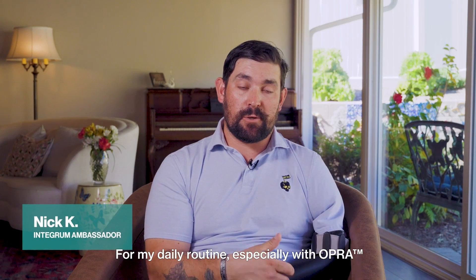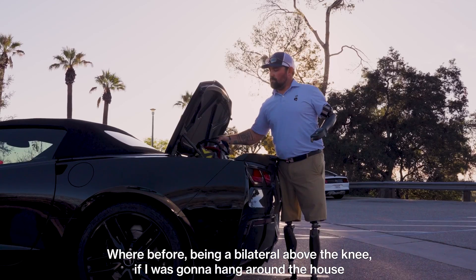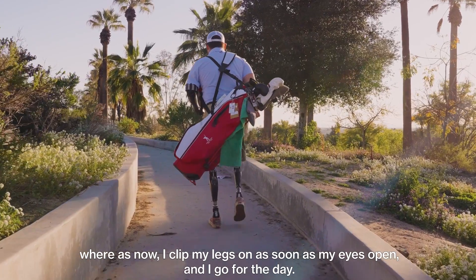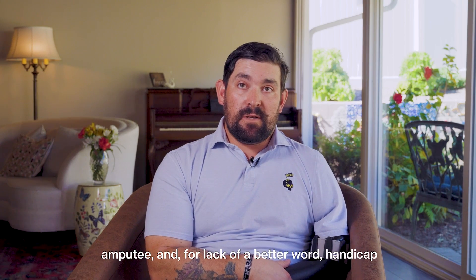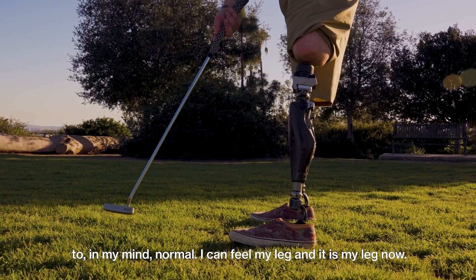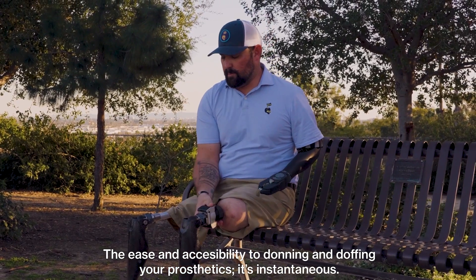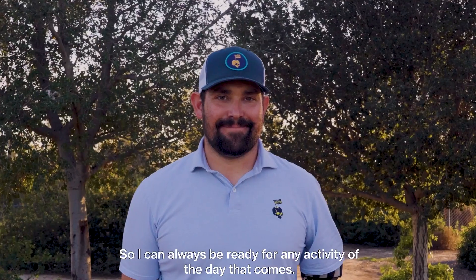For my daily routine, especially with OPRA, I like to say: if my eyes are open, my legs are attached. Before, being a bilateral above-the-knee amputee, if I was going to hang around the house, there was a good chance I'd just stay in a wheelchair. Now I click my legs on as soon as my eyes open and go for the day. The ease and accessibility of donning and doffing your prosthetics is instantaneous — it takes seconds — so I can always be ready for any activity.